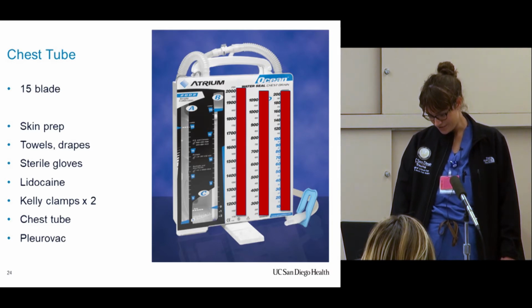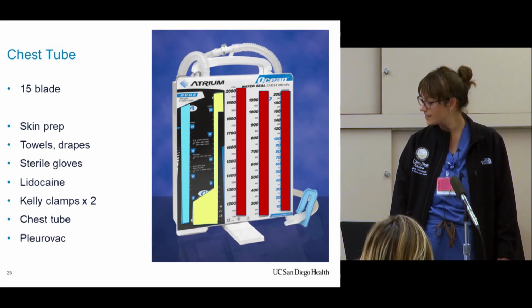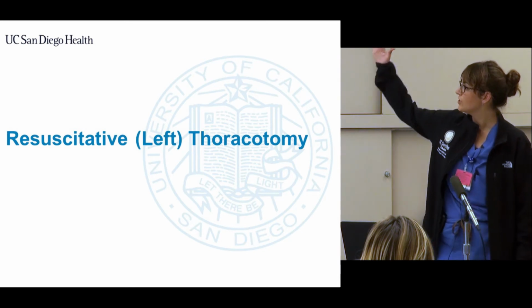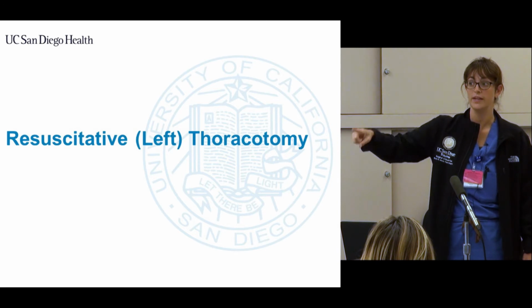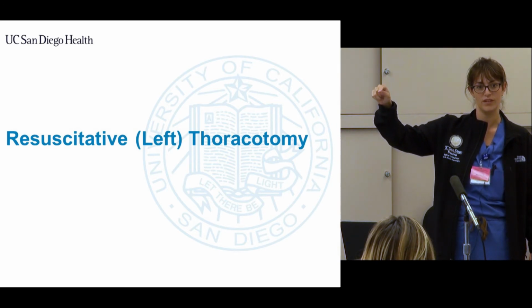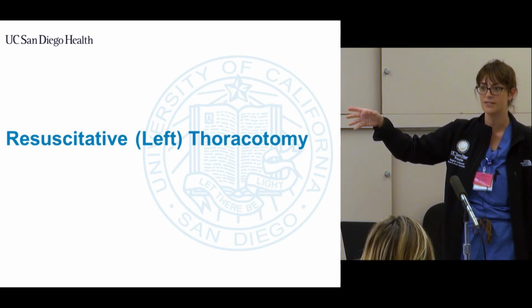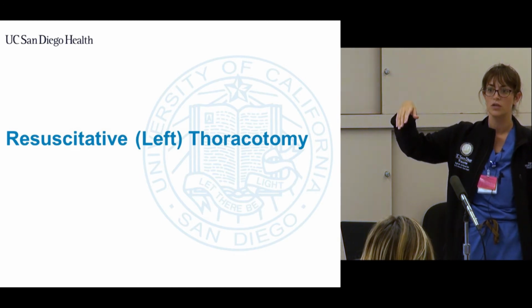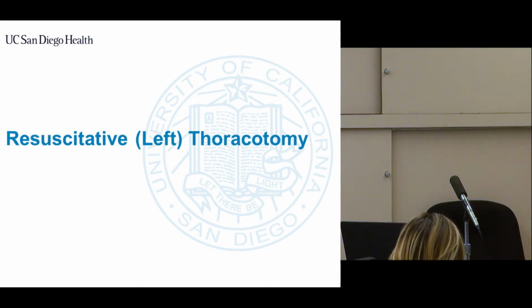So, it wants me to show it to you. Okay, so that one's full. So basically, you have the 3 chambers. One fills with fluid, lets the air through. One is the U-pipe like you have in your toilet that prevents you from dying from toxins in the sewer. This prevents the patient from having backflow of air, causing them to have a tension pneumo. Same concept. And then the last one's the pressure differential. So if it's not at 20 centimeters, is the pressure adequate, that differential? No. So you refill it at the bedside. You're checking it daily.